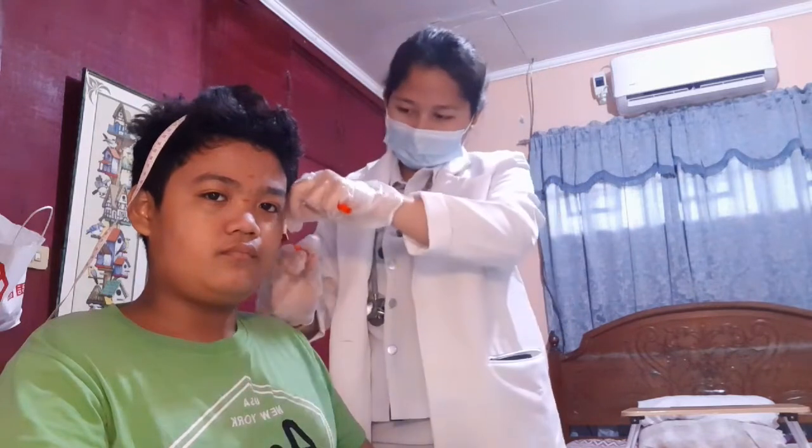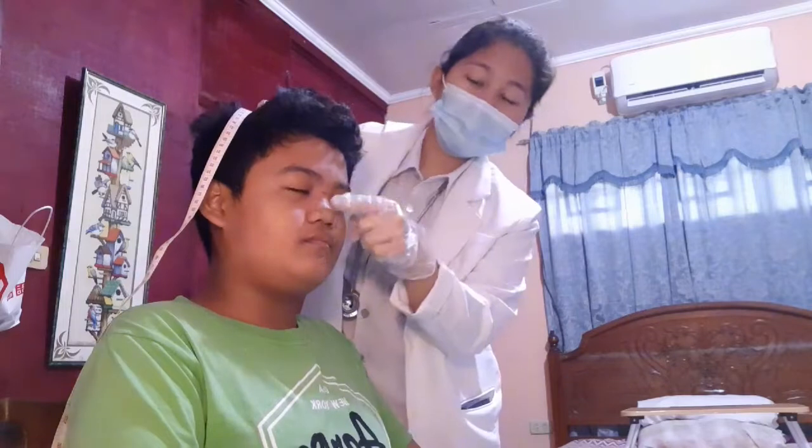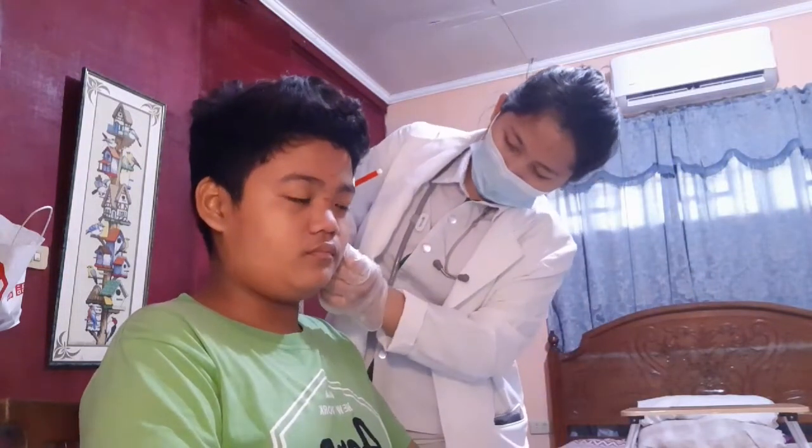Just like the nasion to inion, 40 centimeters. So, mark the landmarks here. 40 centimeters up to the 10%, so 4. We will measure it into 4, just like what we did in the nasion part.